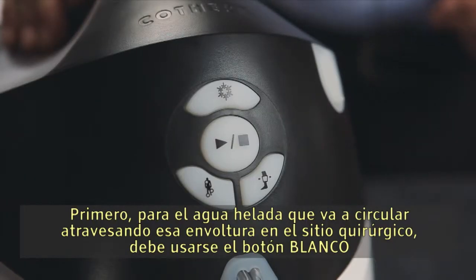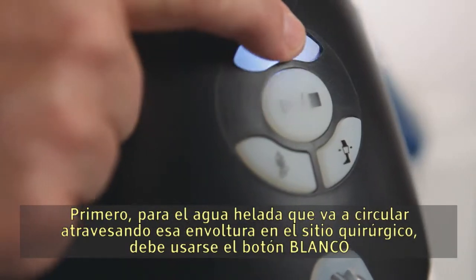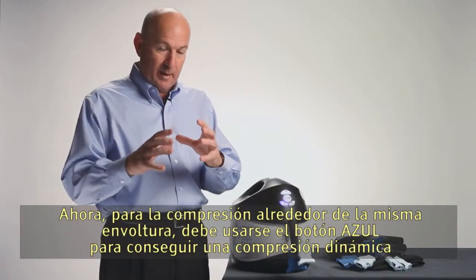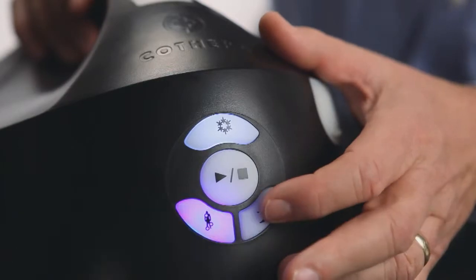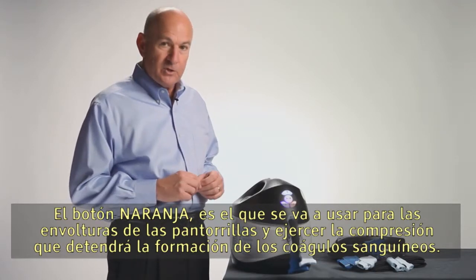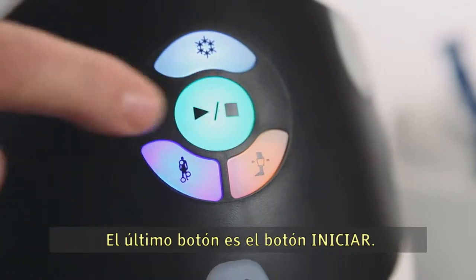To begin your session, select each of the therapies. First, for the ice water circulating through the wrap at the surgical site, press the white button. For compression around that same wrap, press the blue button for dynamic compression. The orange button controls the calf wraps and compression there, which helps stop the formation of blood clots. The last button is the start button.